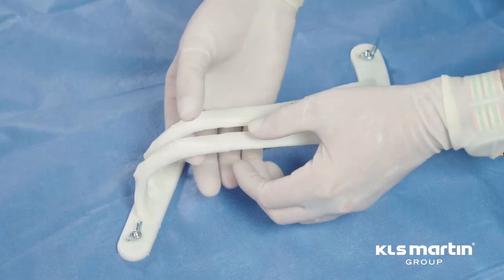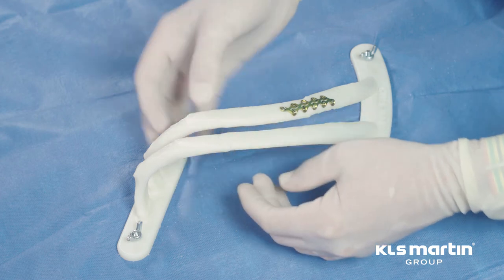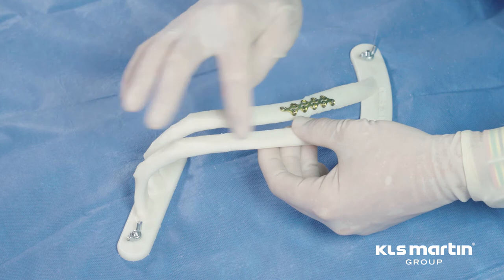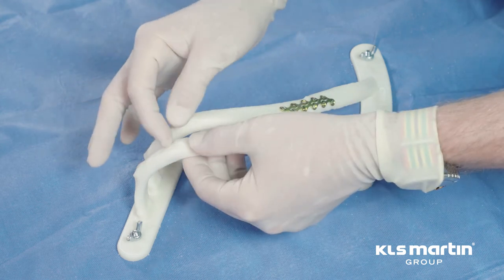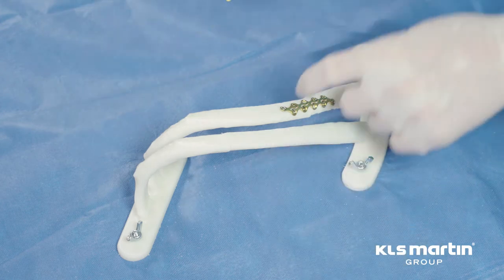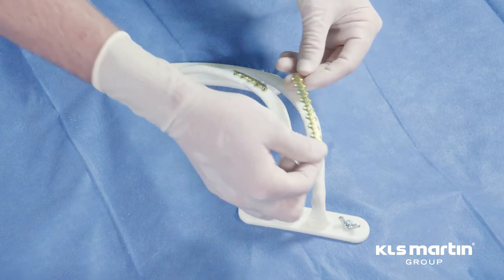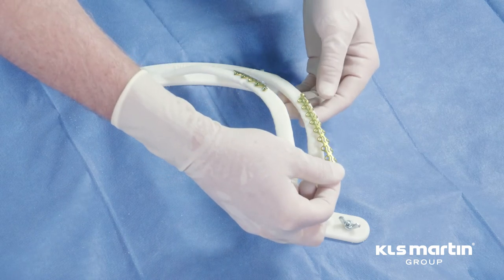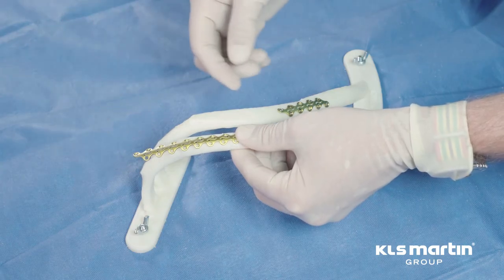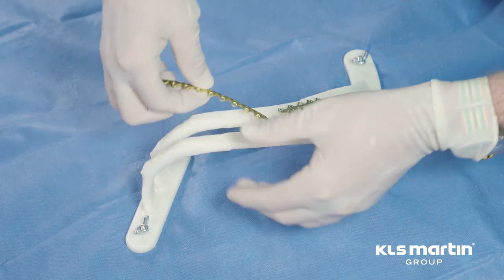Next we'll demonstrate repair of a fracture that's a little more complex — it's comminuted and oblique, and this area of the rib has more curvature and requires a more complex bend. A 10-hole plate would not be long enough for this construct, so we will select the 20-hole variety and cut it down to size. I want to have at least four screws on each side of the fracture line, two in the middle, and four additional — so we'll cut the plate there.